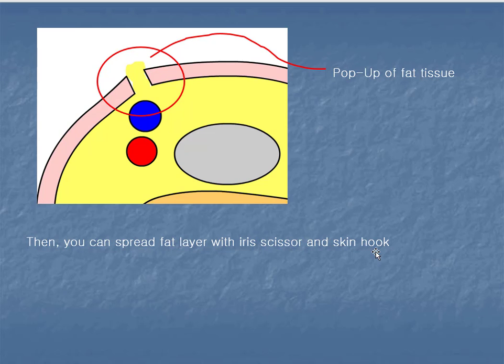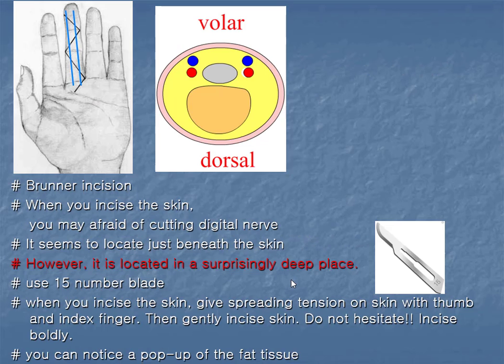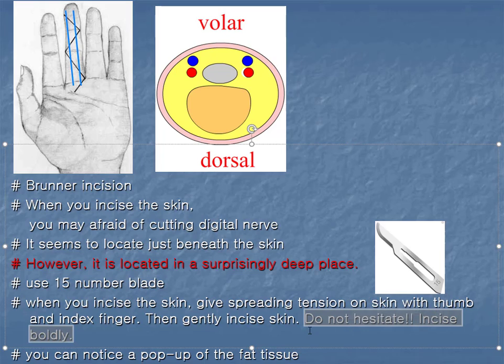Then you can spread the fat layer with the iris scissors and skin hook. As I mentioned before, do not hesitate — incise boldly. It is really important.